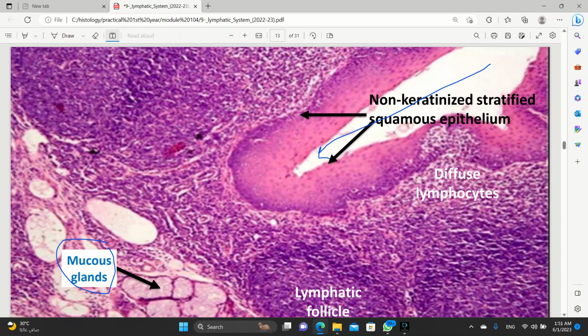I'm going to write it out: crypt ends with a T, and tonsil begins with a T. Always remember that part. We're highlighting that. Yeah. So crypt ends with a T, and a tonsil begins with a T. Anyway, any crypt is definitely a tonsil.